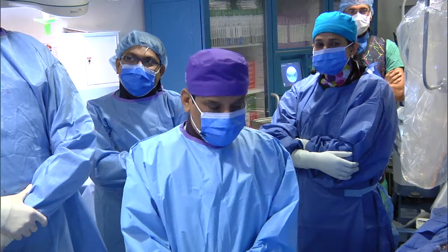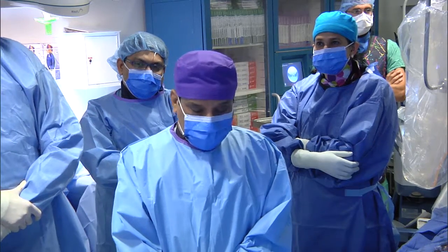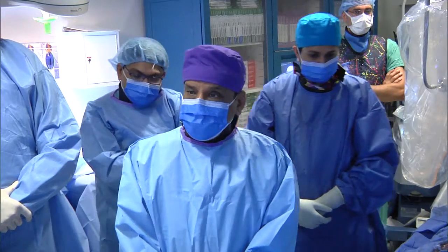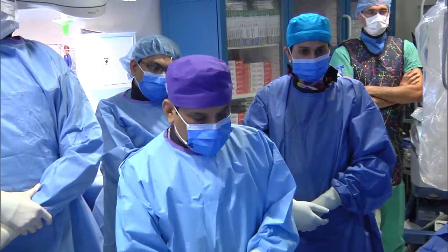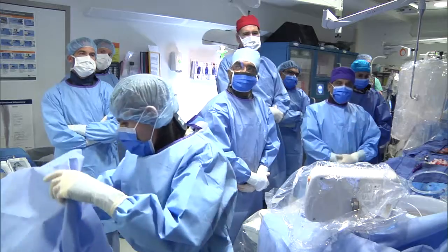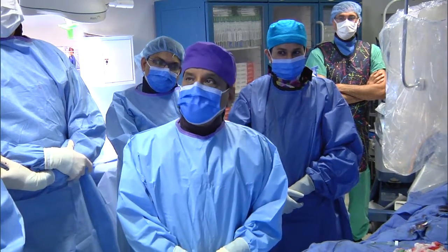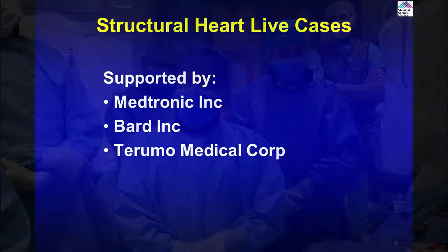This is a very interesting case, with some salient points. Our team includes Dr. Kinney on my left side, Dr. Kovacic on the right side with the fellows, cath lab staff, and echo, and of course surgeon Dr. Alan Stewart just coming in. We start the case with the slide presentation, and we'll have other time for further discussion. So if we can start the slides.